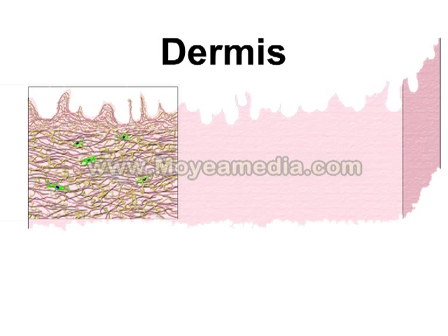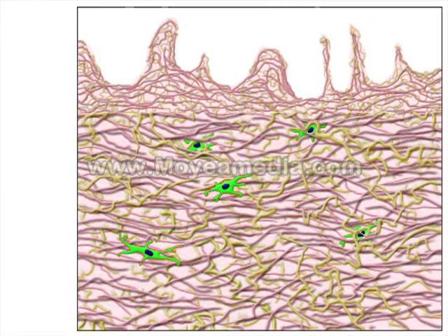Antigen-presenting dendritic cells, both a factor 13A positive population and a CD34 population, are noted within the dermis. Higher power, we see the papillary dermal collagen as much looser, and then below that the coarser reticular dermal collagen, and embedded within that the dendritic cells.